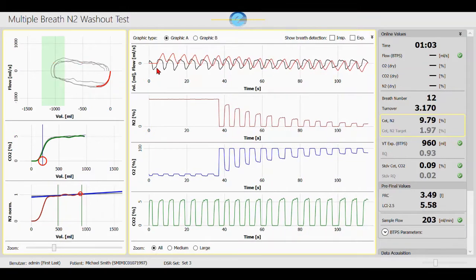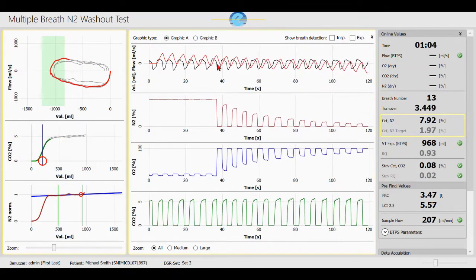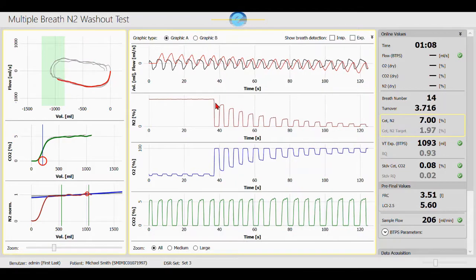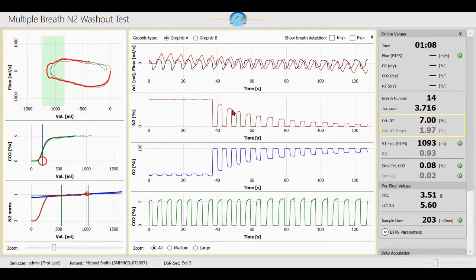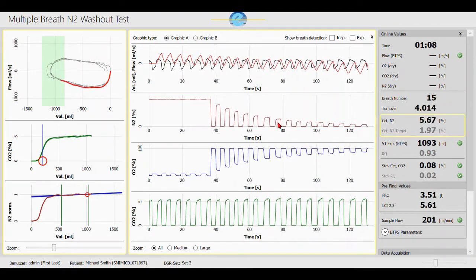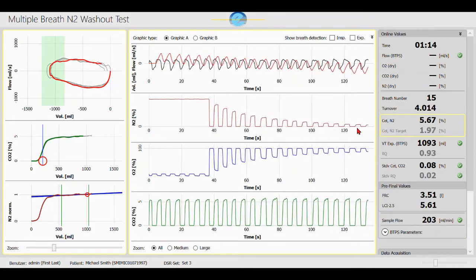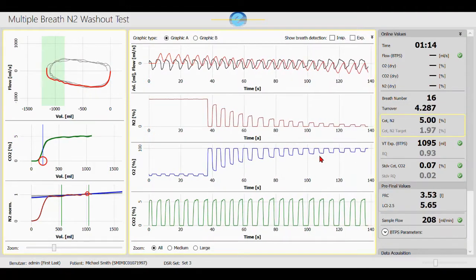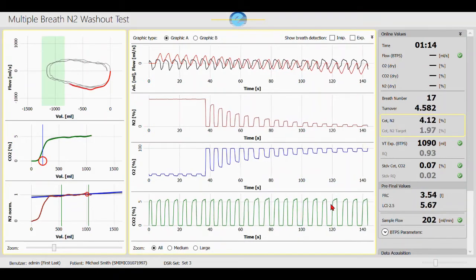In the center, we have the flow in black and the volume in red. Below, we have the nitrogen concentration, where we see that the end tidal nitrogen concentration decreases with every breath, then the oxygen concentration and the carbon dioxide concentration.